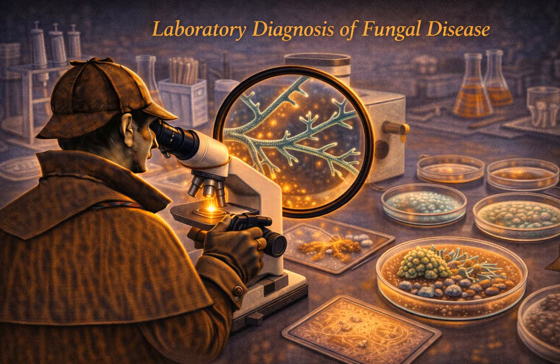Exactly. It does not identify the genus or species, but it is incredibly useful for its negative predictive value. If the BDG test is solidly negative, it is very, very unlikely the patient has invasive candidiasis or aspergillosis. It gives the clinician the confidence to stop the toxic, expensive empirical antifungals. But there is a massive blind spot here, a trap that we alluded to earlier with the grinding trap and the cycloheximide trap. Yes, there is, and it's deadly if you don't know it. Not all fungi have 1,3-beta-D-glucan in their walls, or at least they don't shed it in detectable amounts. The two big critical exceptions are, you guessed it, the Mucormycetes and Cryptococcus.